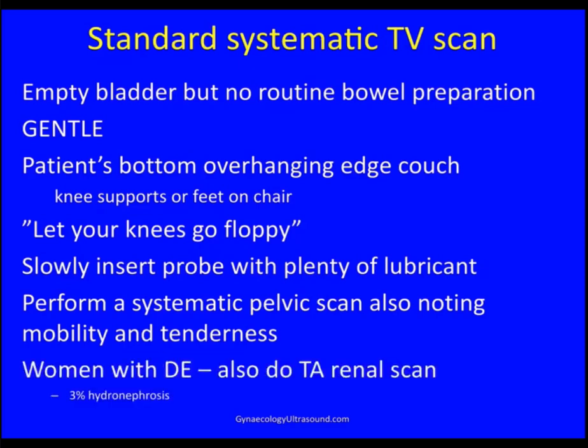And if I see any endometriosis, I'll also do a transabdominal renal scan, as some of these women have silent hydronephrosis.